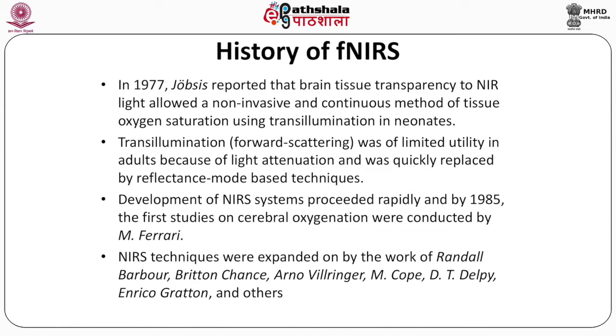This trans-illumination, in other words called forward scattering, was of limited utility in adults. Since he studied in neonates, later on it was found that this has very limited utility in adults because of light attenuation, and it was quickly replaced by reflectance mode based techniques.